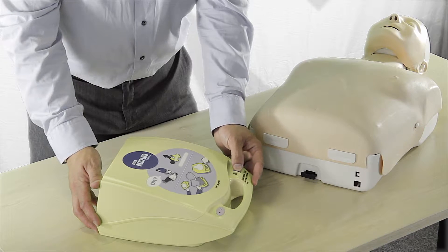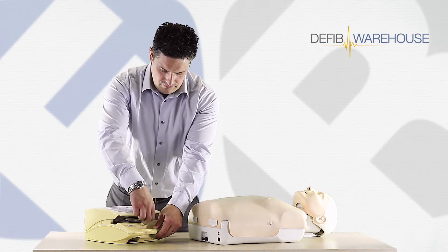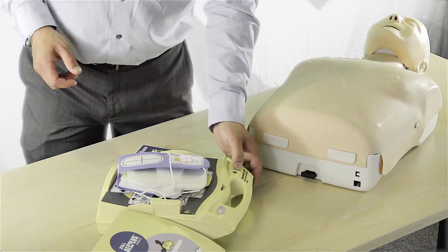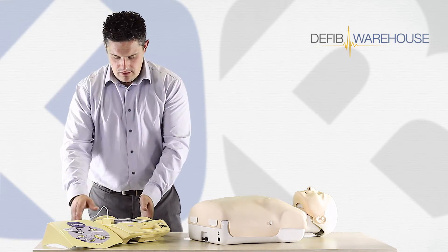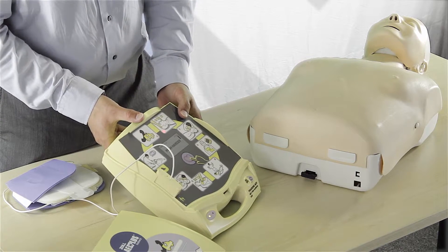We're just going to turn the machine on by the on-off button. Lift the lid. The unit responds: Unit OK. Stay calm. Check responsiveness. Call for help. You can see our prompts on the machine — just let this run through its prompts.